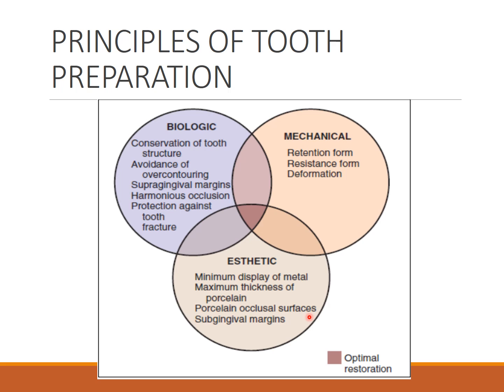Porcelain on the occlusal surface, yes, because inside there is a metal layer. Maximum thickness of porcelain should be there, and there should be a minimal display of metal. Guys, this is basically the aesthetic preparation, and it will be maintained long term.